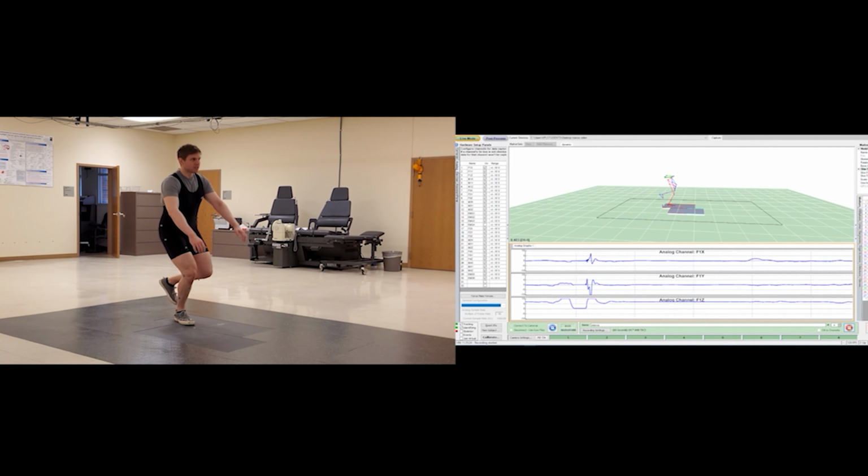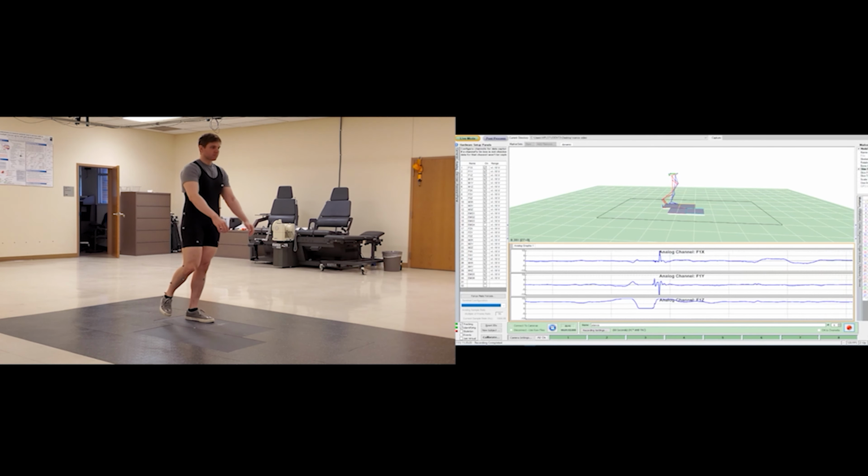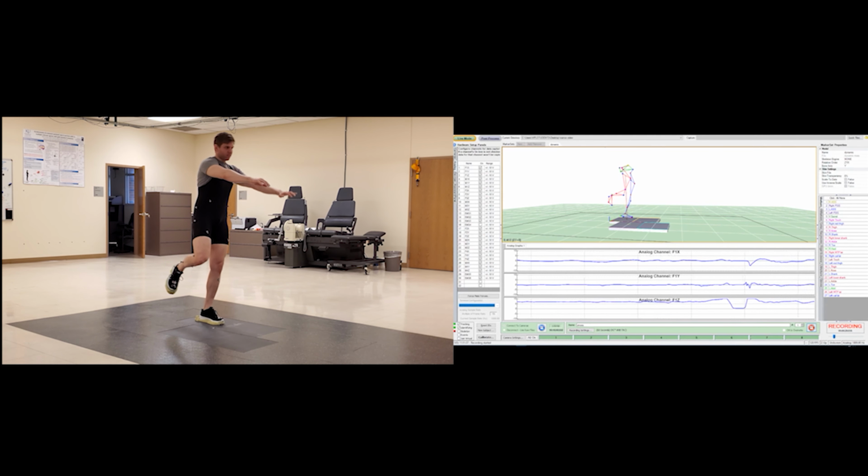Once you collect ground reaction forces for a subject, how do you look at the change in them or something like that to determine if any effects are occurring?